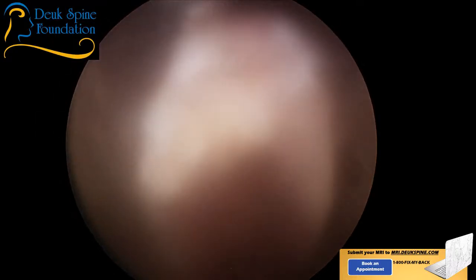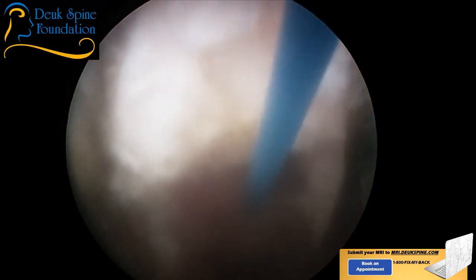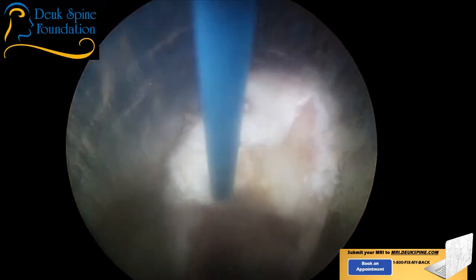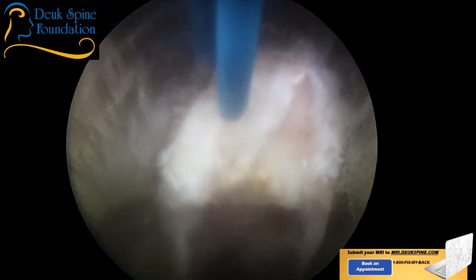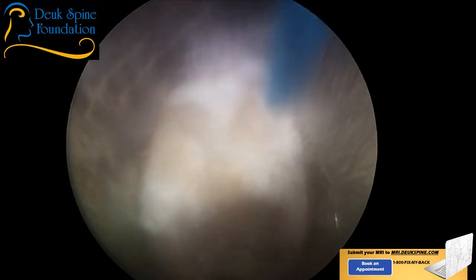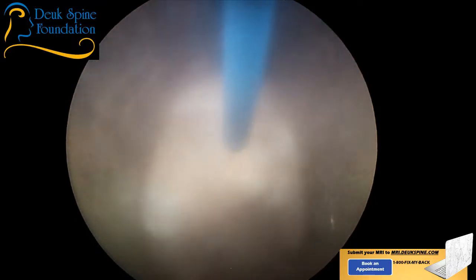This is the end of it right here. This was really hard to get into, as you remember. I tried going up to the top, going a little more medial. It didn't work. So this, actually, I got lucky again. This is the annular tear. This is the end of it. We're almost done. I need 5 minutes and we'll be done.